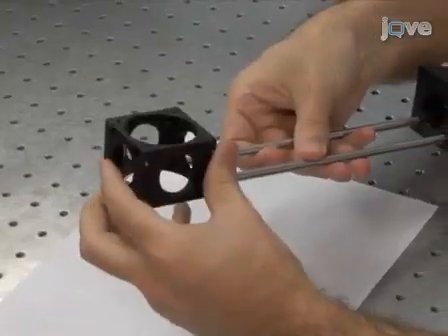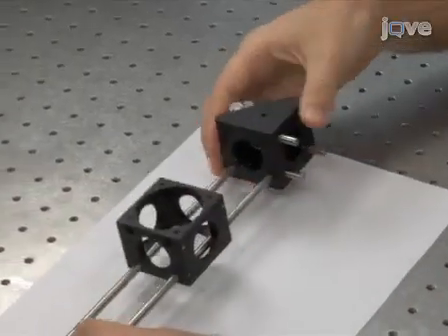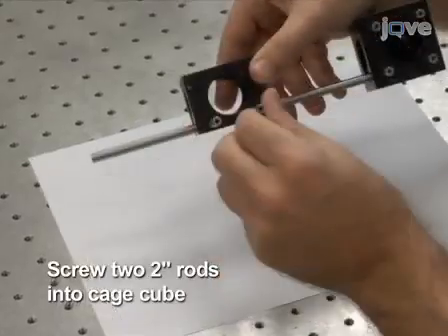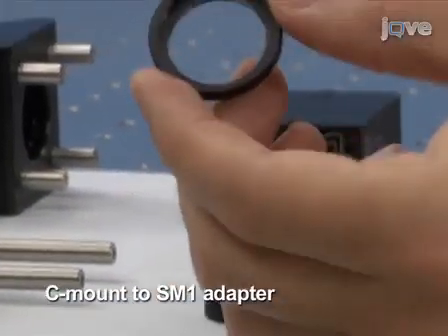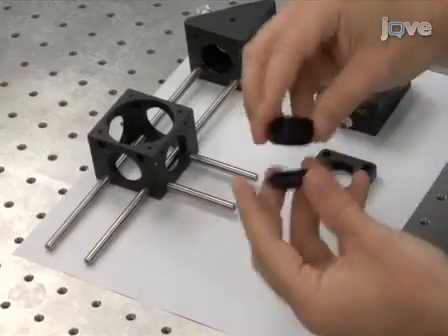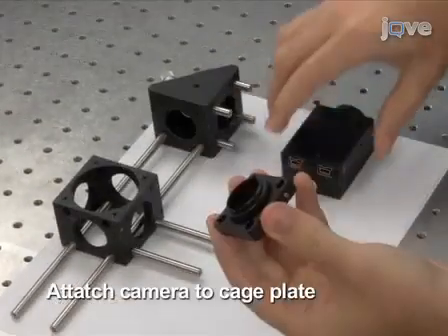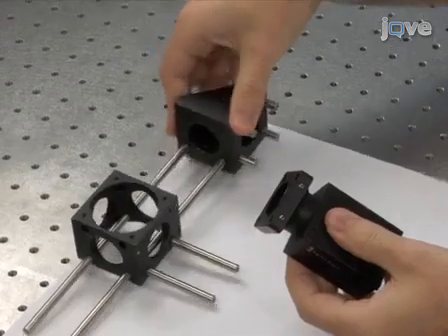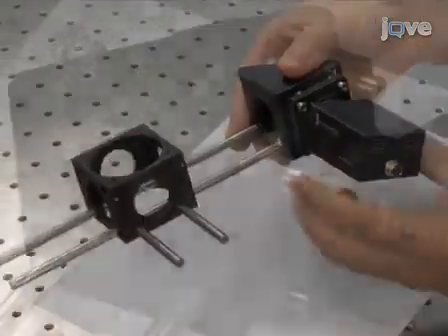Slide the cage cube onto the 7.5-inch cage rods via the two lower through holes. Screw the 2-inch rods into the side face of the cage cube. Using a C-mount to SM1 adapter, attach the camera to a cage plate. Secure the cage plate on the 0.5-inch cage rods flush with the face of the fold mirror unit.